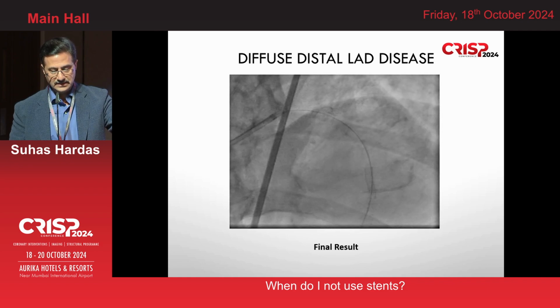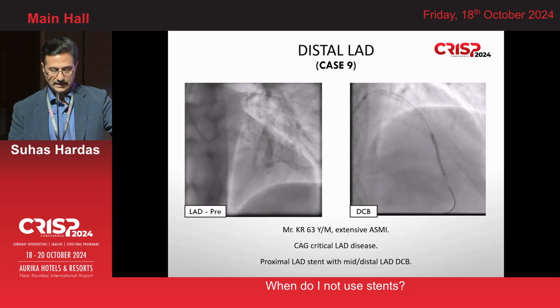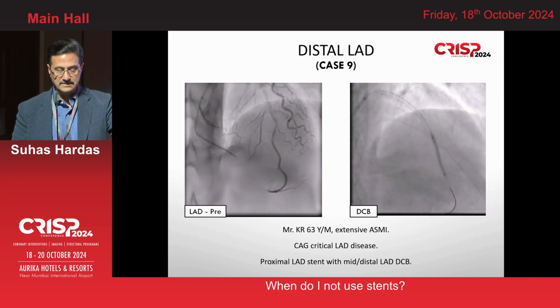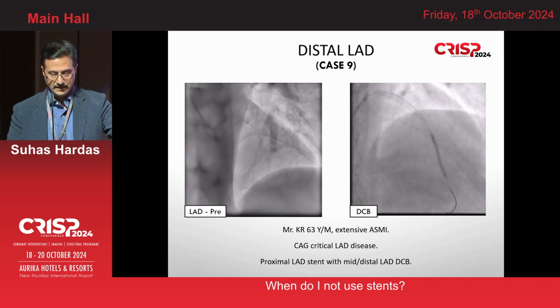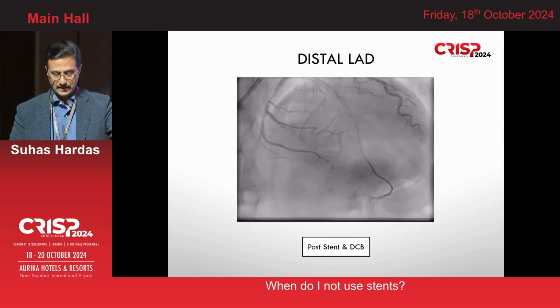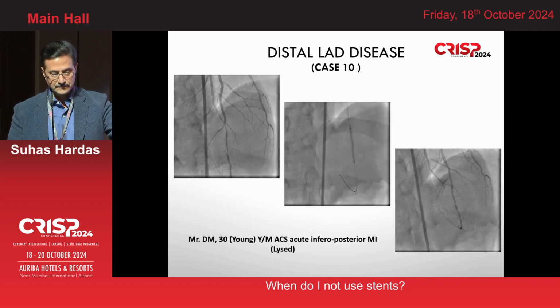In a situation like this where you have one focal lesion, a stent can be used and the distal LAD can be balloon dilated. This is once again a similar situation where the distal LAD was dilated with a drug-coated balloon, and long-term patency is still very well preserved.